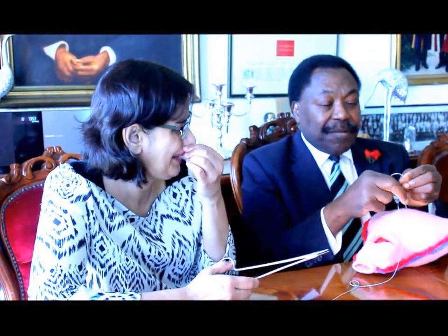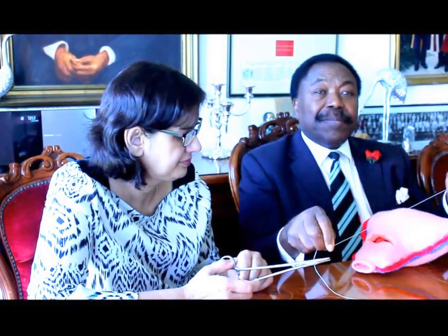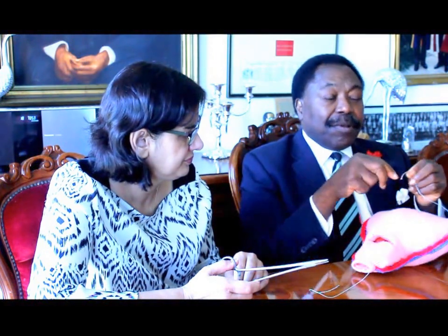Firstly, this is a model that we have created in soft wool to apply the suture. Secondly, the suture material ideally should be Vicryl number one, mounted on a 70 mm curved needle, with a suture length of 90 cm to allow enough suture material available for the purpose.